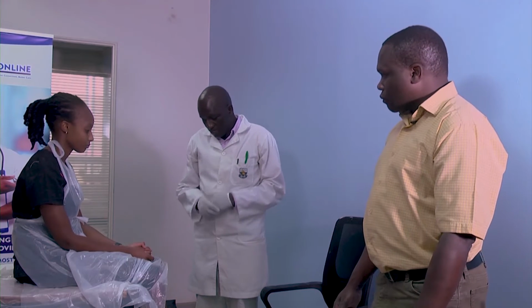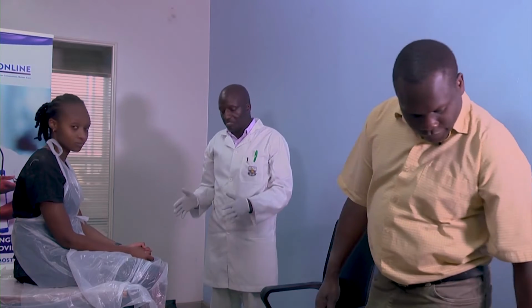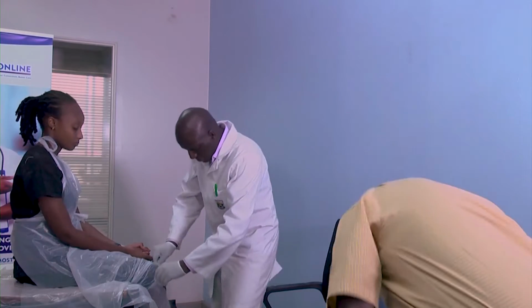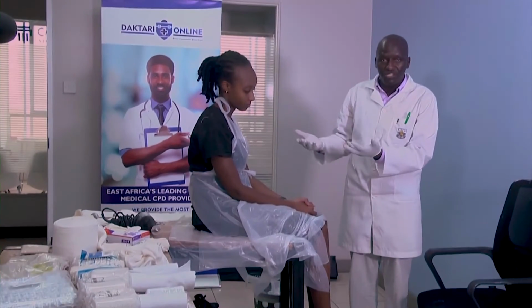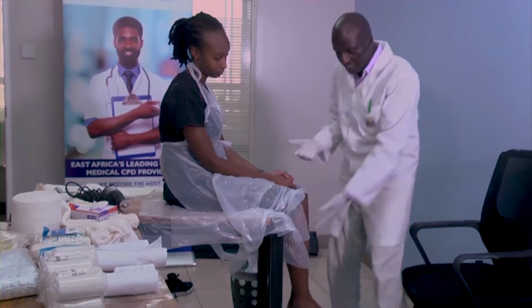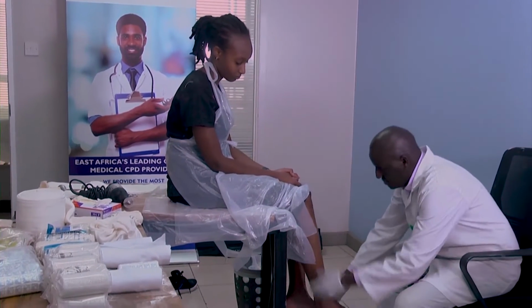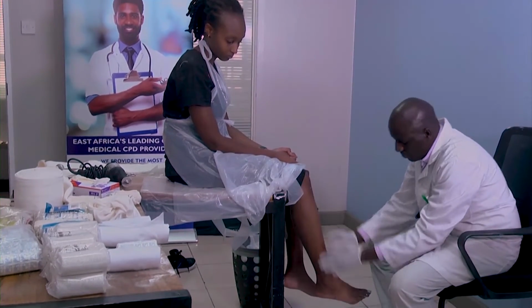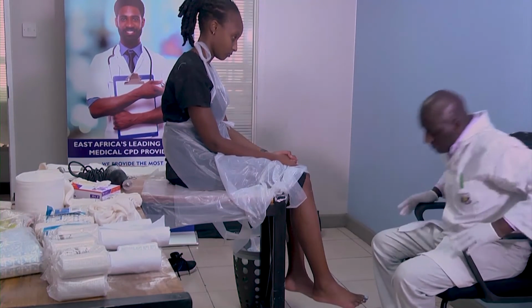Thank you. So we are going to apply a below knee posterior slab, or a below knee back slab. For the lower limb, positioning is very important, especially with lower limb injuries. So you can see our patient is on a table or a couch. As long as it's raised, ensure the foot is hanging, because we want that gravity. The hanging of the foot is very important.